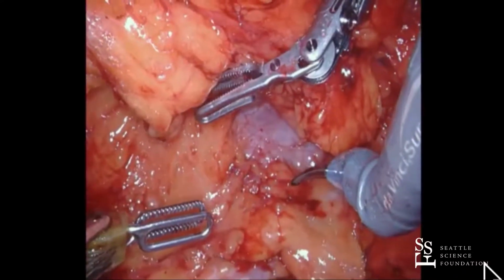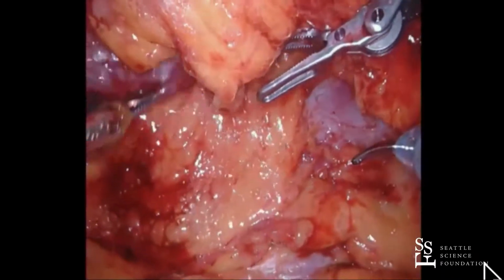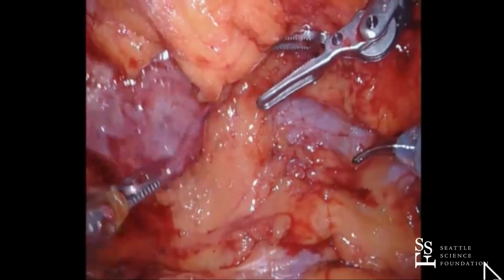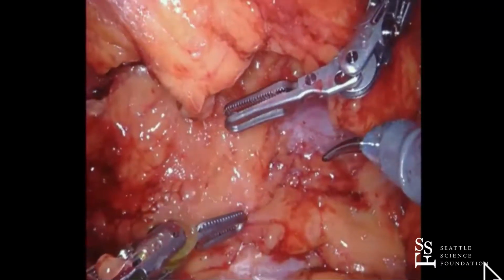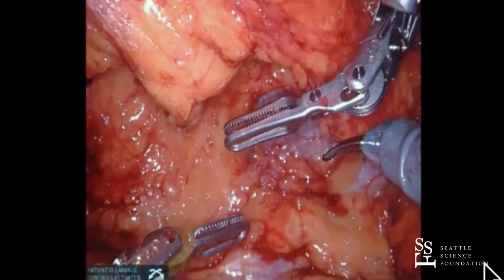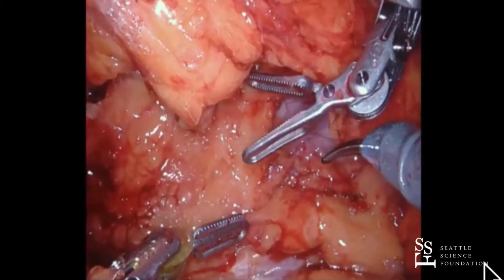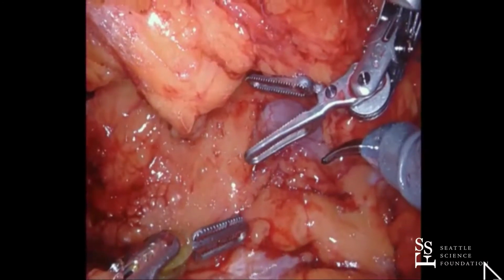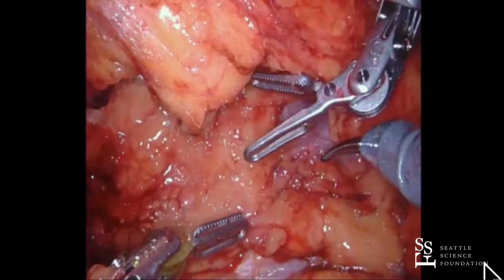Jim, where is your cut edge you made into Gerota's? Yeah, it's up here now, right here, you see it? Yep. So it's way up there, it flew up when I released it. Are we good, Brando? No, I don't need clearance. I just need the arm separated a little bit, okay? Actually, go ahead and give me clearance on the fourth. Go ahead and give me that.